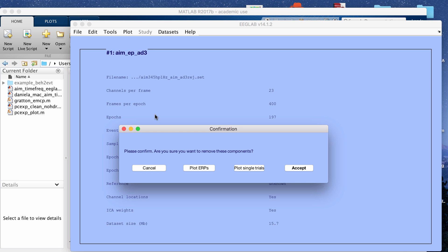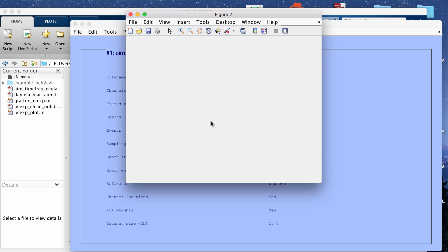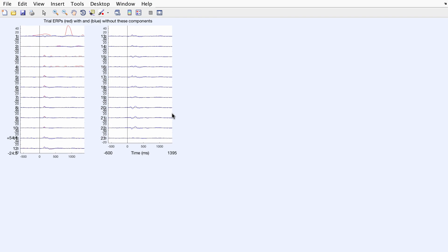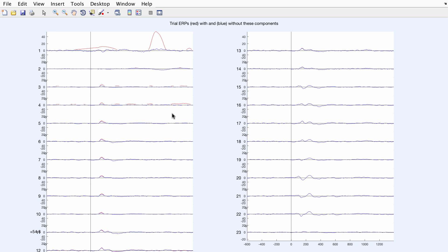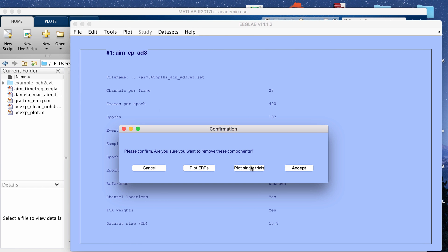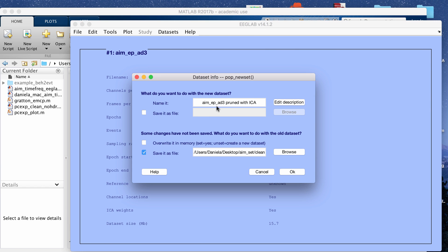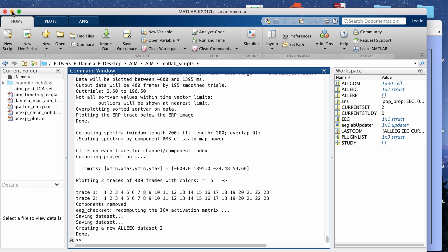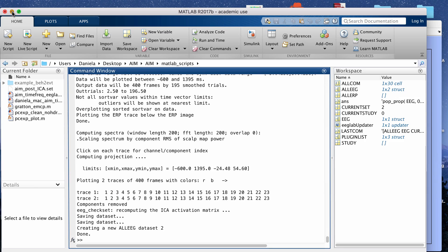Let me go ahead and check plot ERPs. This will open up a window comparing the ERPs before and after. This looks OK to me. So I'm going to click accept and then it's going to let you save the file before the ICA is removed and after the components are removed. So I'm going to save it as aim post ICA and click OK and that runs really quickly.